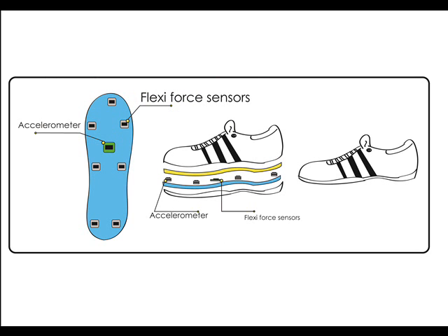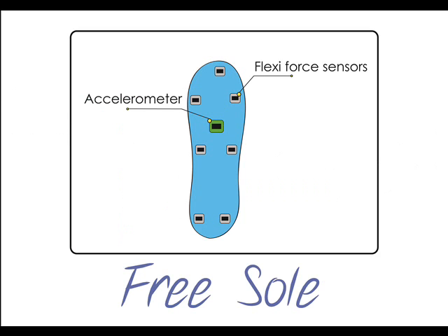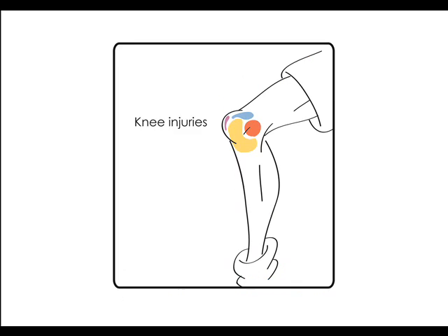We designed a device that allows recovery patients from knee injuries to do the bike exercise section of the recovery and strengthening process remotely in the outdoors. Free Sole is a sole that can be coupled to any sport shoe, therefore it's wearable. The Free Sole has 7 small FlexiForce sensors displayed in specific spots of the sole to measure the area of the foot which is under stress. In this way, the device can also know which section has been exercised, even which section of the knee.